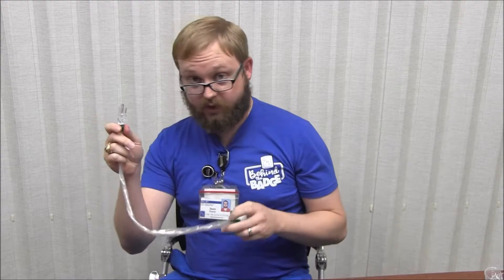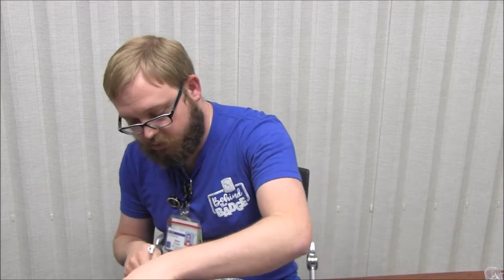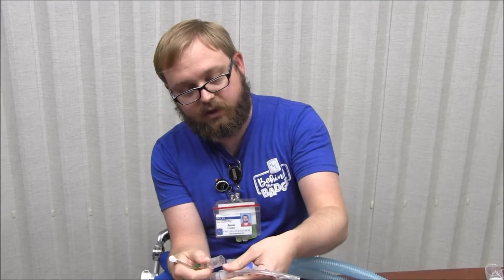Not always is your patient going to be stable enough to just pop them off the ventilator, so we have another method — the one you're used to. We have our inline catheter, and we want you to change it out every time you get a sample, even if your patient just got intubated and the inline suction has only been used once. Go ahead and grab a new inline catheter — those can be found in the respiratory supply room. This can be a one-person technique.